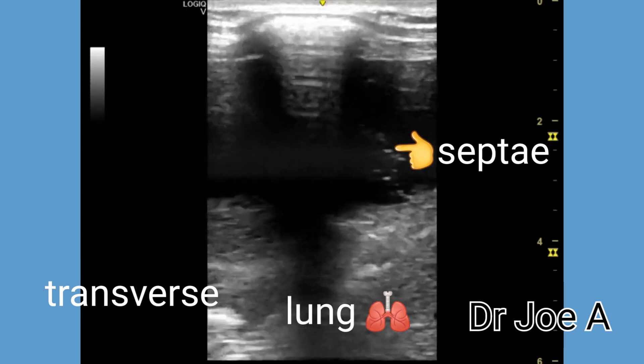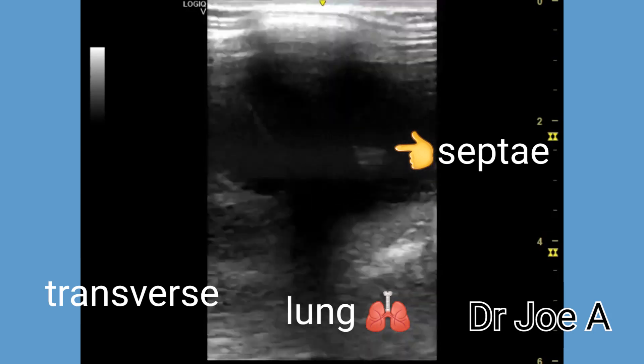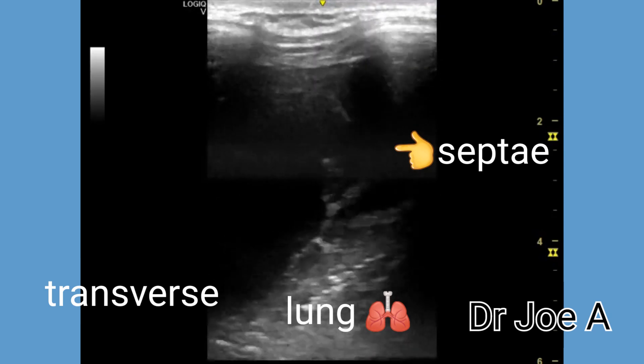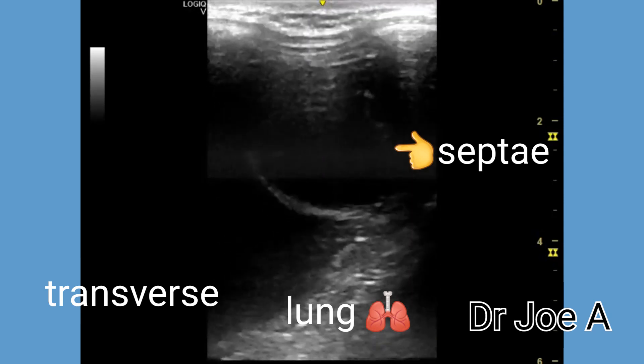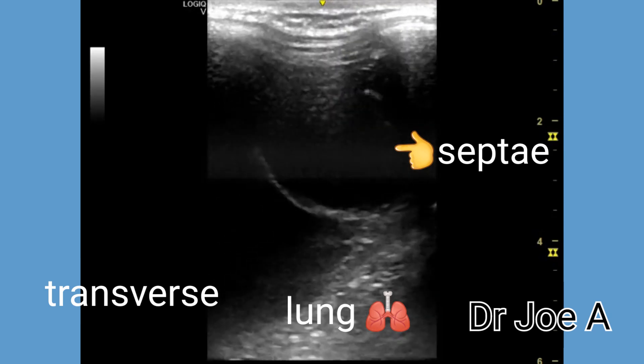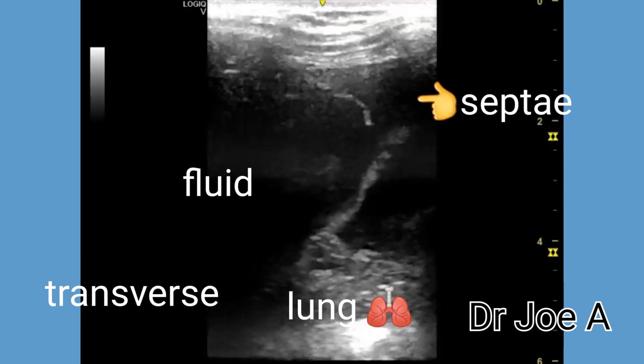A septate pleural effusion can be seen on ultrasound as multiple fluid pockets separated by echogenic septations.